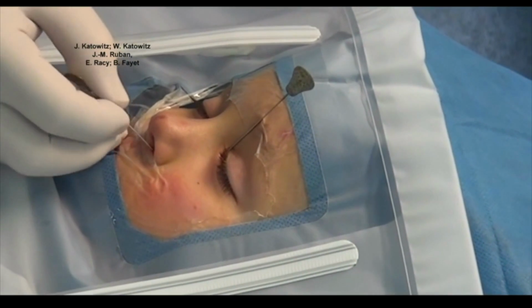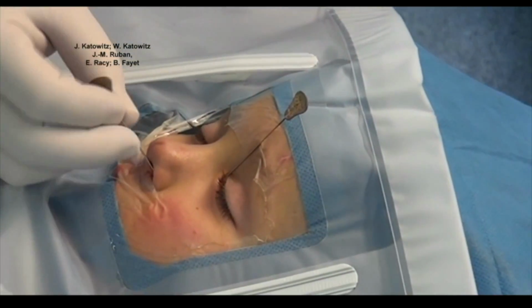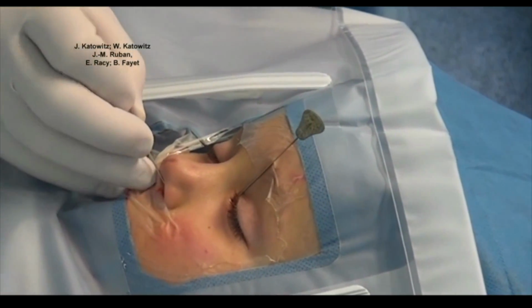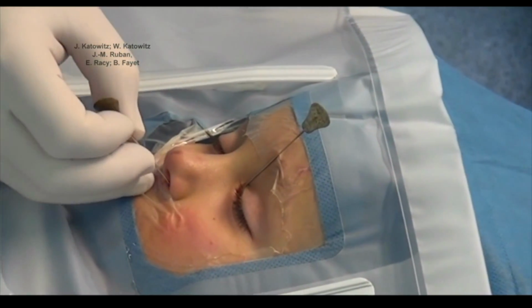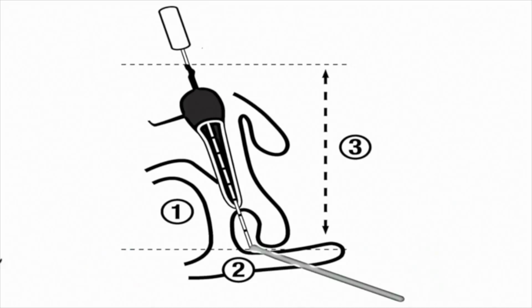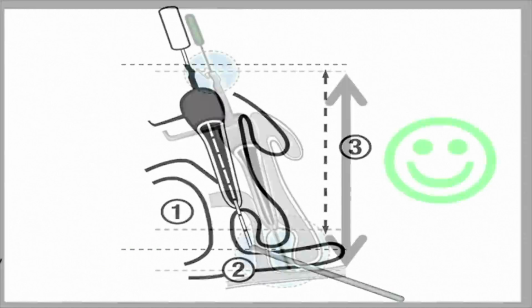If there is no metal-to-metal contact, it may be that there is a false passage. In this instance, the probe should be withdrawn, and a second attempt can be carefully tried using the opposite punctum and canaliculus. If this is not successful, then a more significant intervention will have to be considered, usually at a later date. Third, how do we select the correct length of the MASTERKA?